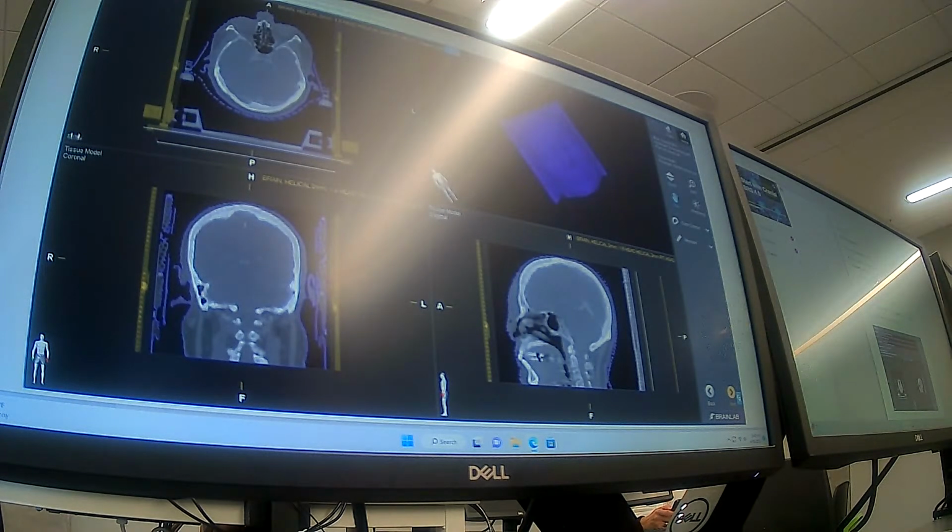What would be the purpose of a localizer box if you already have a mask? It's not that simple. The localizer box allows you to do spatial recognition. They usually put templates on it. You can see where the lines align to the isocenter. Okay. They don't do that anymore. We've moved way past that. But there are some people who probably still use it.